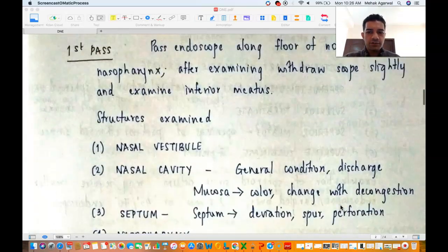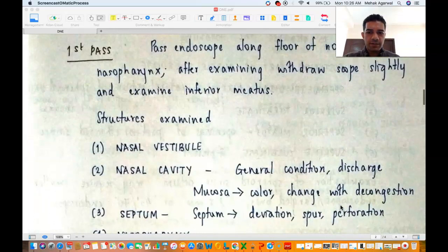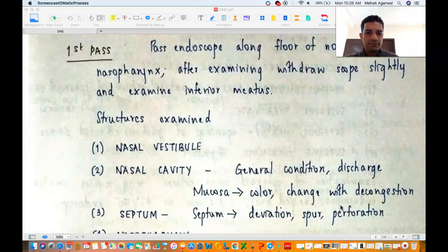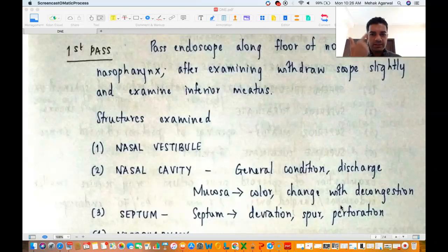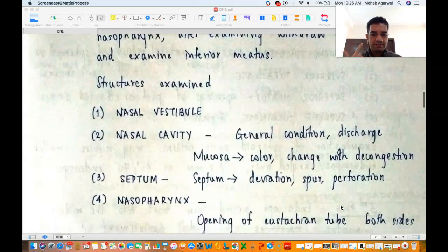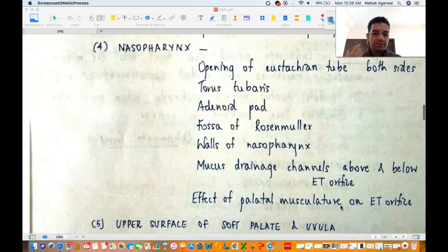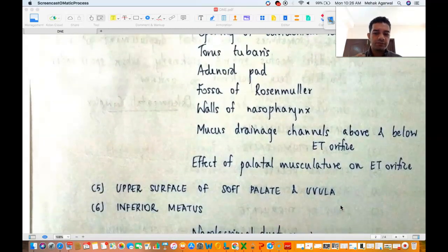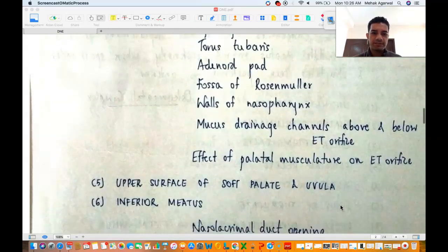So in the first pass, you pass along the floor of the nose, go into the nasopharynx, come out, and see the inferior meatus. You examine the nasal vestibule, nasal cavity, septum, nasopharynx, upper surface of soft palate and uvula, and the inferior meatus.